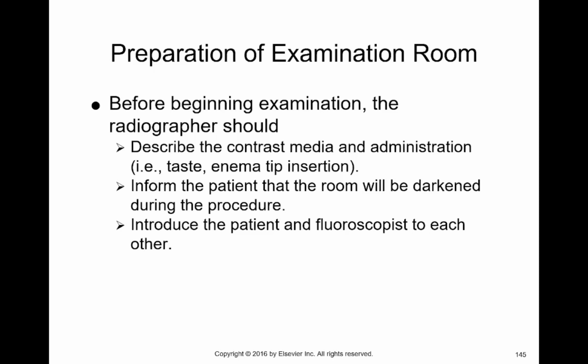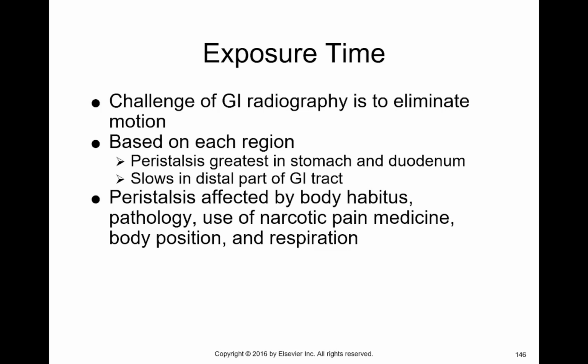It is awful. It's really bad. The barium is not as bad, but it's real chalky. So it's kind of like flavored chalk, as opposed to the iodinated contrast. It tastes like a dirty trash can. You put a little bit of water in it, stirred it around, and then gave it to somebody to drink. It's pretty disgusting. So the enema tip insertion obviously does not have a place here.